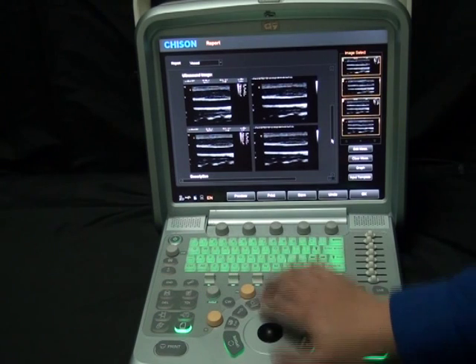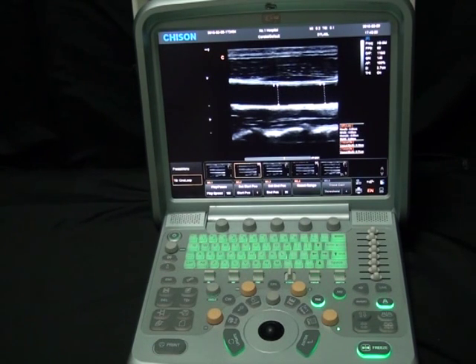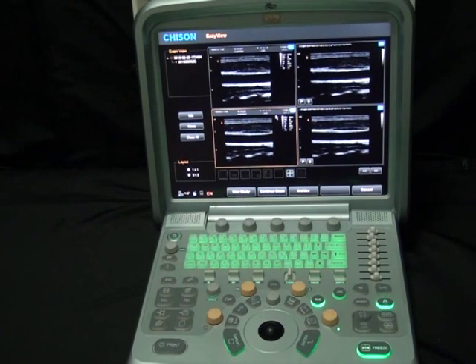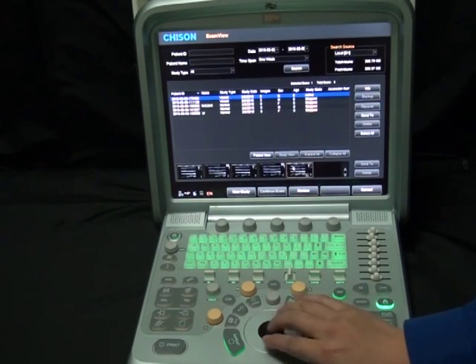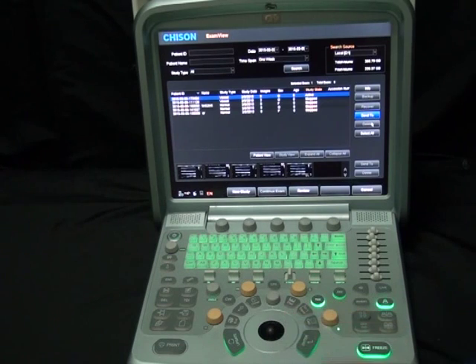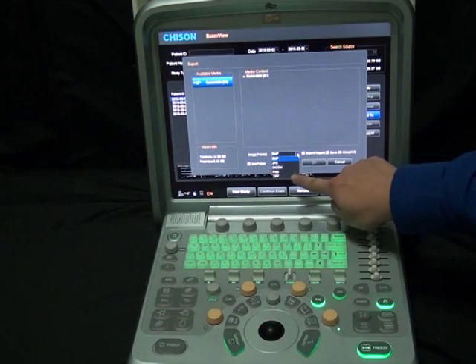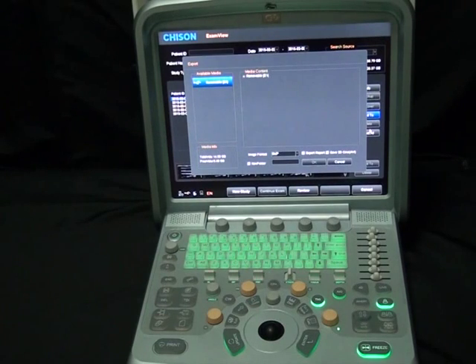Press the print key to print the report in different formats — we support both video printer and PC printer. As images are saved in the machine, there are several ways to export them to a USB disk. Insert the USB disk, press the archive key, select archive, then choose to send or backup the images. We can choose different formats for the transfer: BMP, JPEG, DICOM, PNG, or TIFF. The send option transfers files directly to AVI format, so you can read them on a PC directly.